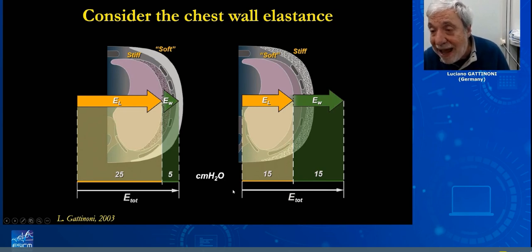In a normal animal, if I use 24 hours of ventilation like this, I kill the animal. Here, it's completely innocent. Here, the hemodynamics are okay. Here is a disaster. And if you do not measure, we just do not know.